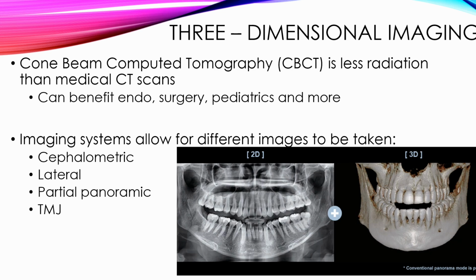It allows us to manipulate, measure, and use it for a lot of different purposes, including diagnosing patients and also educating patients. Because we can manipulate it, we can turn it how we want to, we can show different parts of the oral anatomy, and we can color code it. It just allows us to communicate with the patient easily.